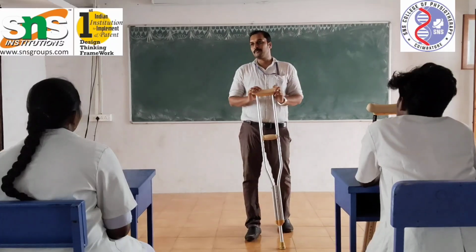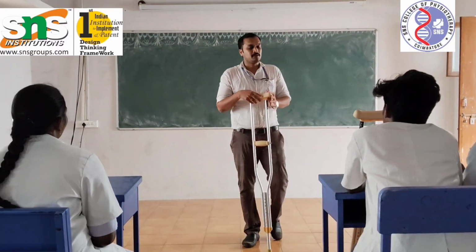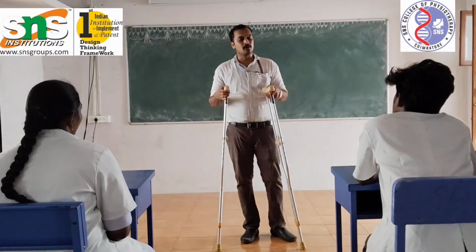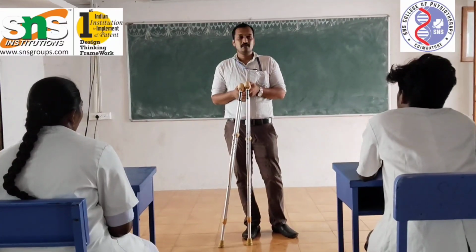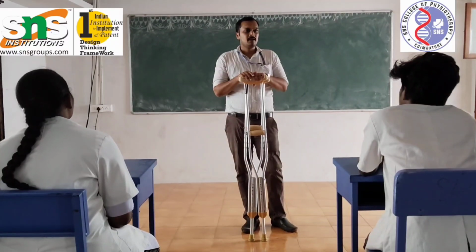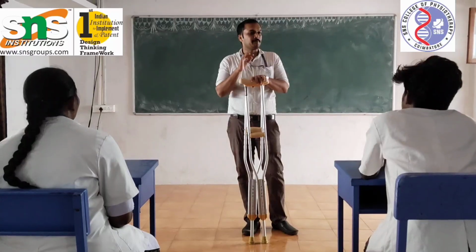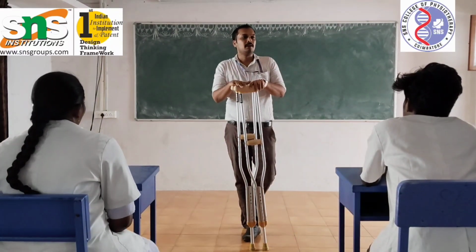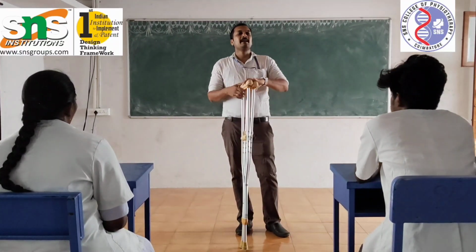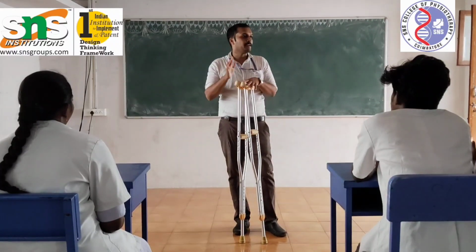Next, what we have to know as a physiotherapist is how to teach the gait pattern. Which type of patients will go with walking aids? Patients who are suffering from muscle weakness or any injuries, who are not able to put their full weight on the lower limb. Only that type of patients we will teach gait with the help of walking aids. We can divide into full weight bearing, partial weight bearing, and non-weight bearing.